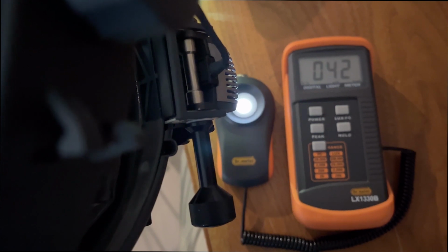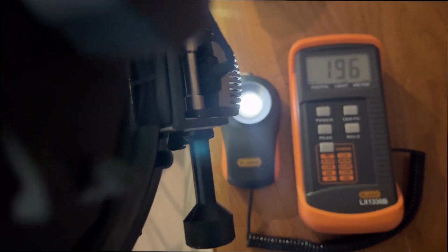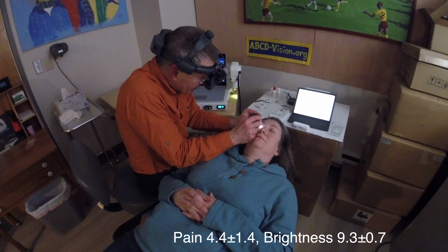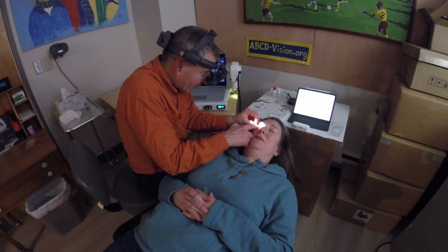Nice. This is the indirect ophthalmoscope on low mag. This is turning it all the way up. There's low mag. Here's turning it all the way up. Full bright. This is the see-through scleral depressor full light. Okay, I would say 4 discomfort, and that was probably like an 8.